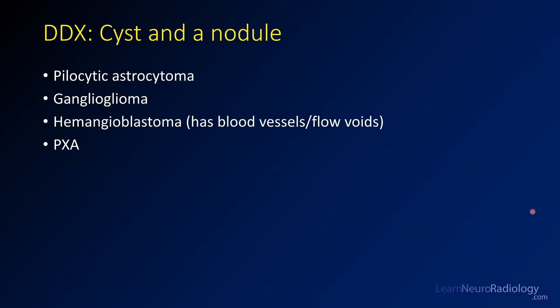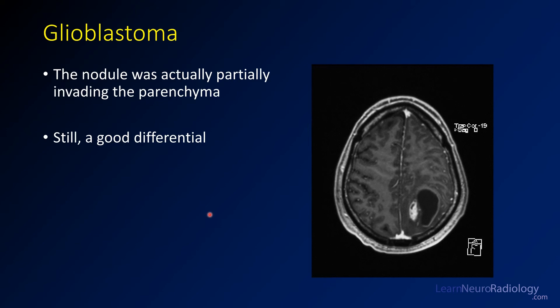Think about the cyst-and-nodule differential: pilocytic astrocytoma, ganglioglioma, and PXA are considerations. Hemangioblastoma wouldn't be at the top here because there are no flow voids visible around it. This one actually turned out to be a glioblastoma. Looking more closely at the nodule, you could see invasion of parenchyma making it appear more aggressive. But again, giving a good differential is the key — you're going to miss some of these, and you've got to give a smart differential.